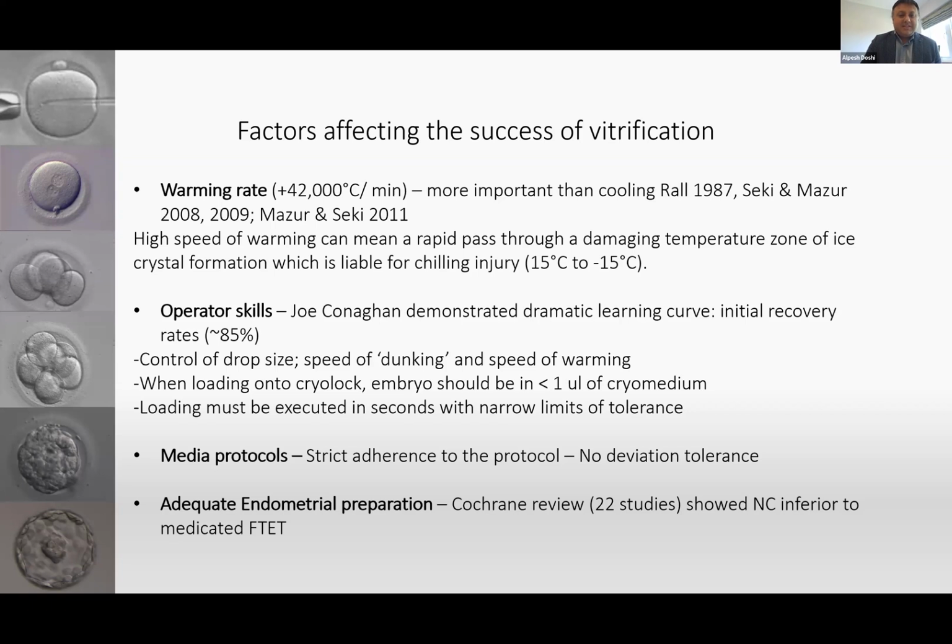Of course, it's quite important to understand that we talked about the size of the drop, which is less than 1 microliter. You want to make sure that the speed of dunking in liquid nitrogen is, again, very fast. Various different media protocols have a very different working protocol. So you want to ensure that you stick to the protocol and do not deviate from it. Because if it doesn't work, you go to your culture media company, or the company where you buy your cryoprotective media from, they will probably tell you, well, because you haven't adhered to the protocol. So try and stay within the boundaries of the protocol rather than innovating your own extensions of what you feel may work or may not work.